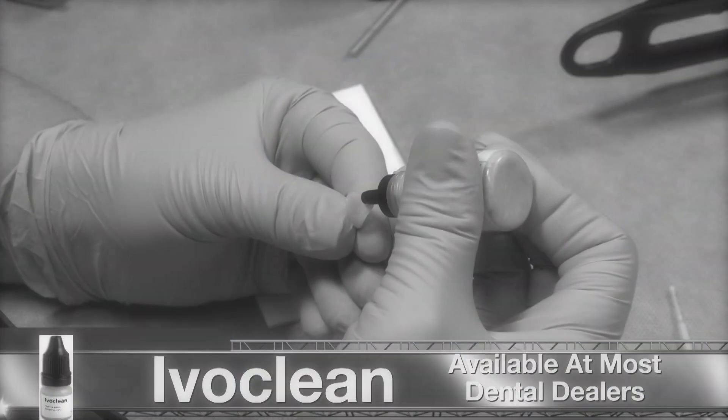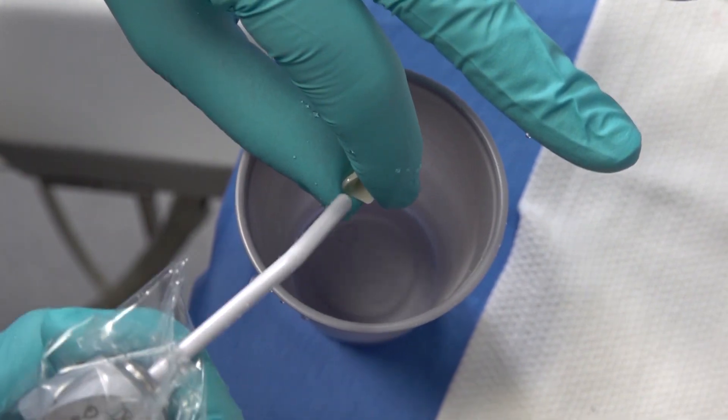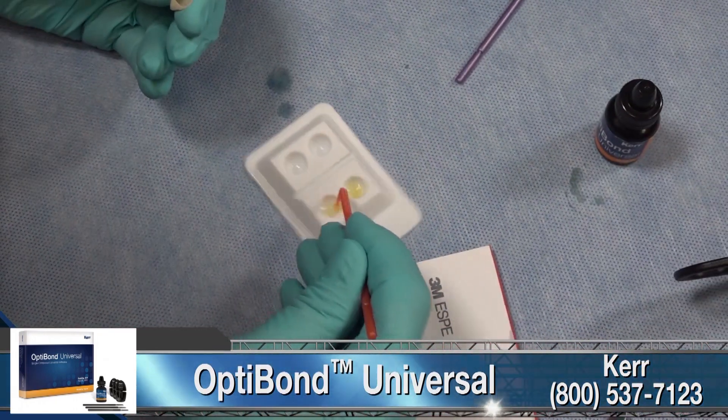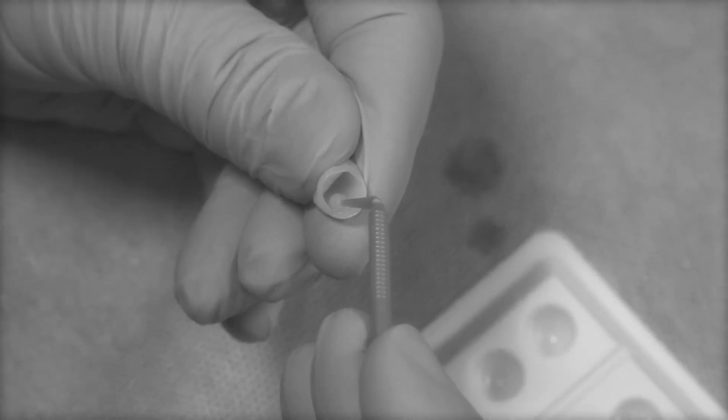After try-in, we clean the restorations out with Ivoclean. We then apply a very thin coat of OptiBond Universal inside the restorations to act as a primer for the zirconia. Once the restorations are cleaned and primed, I begin prepping the teeth for bonding.